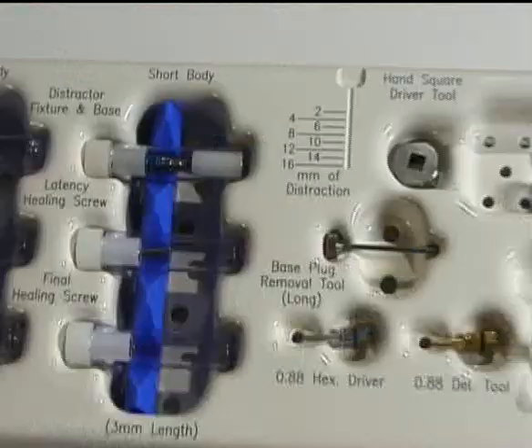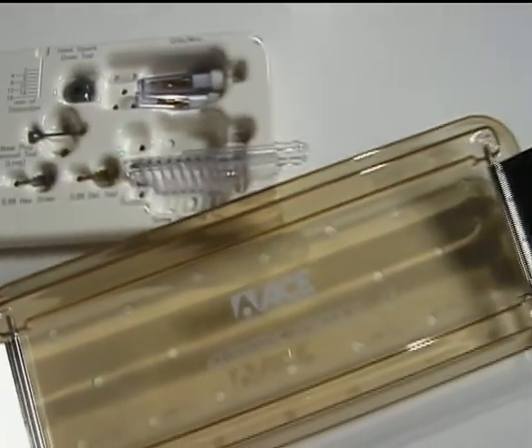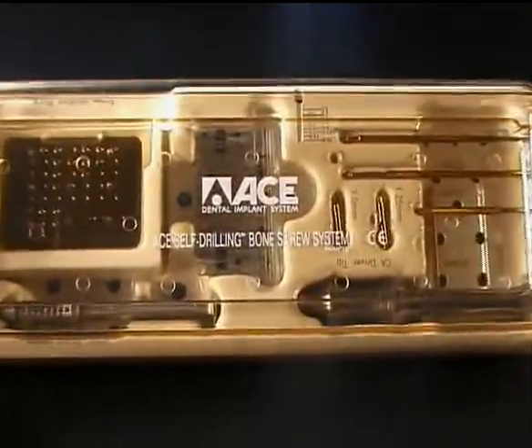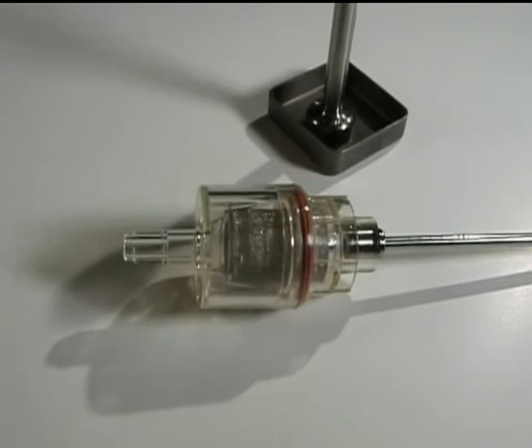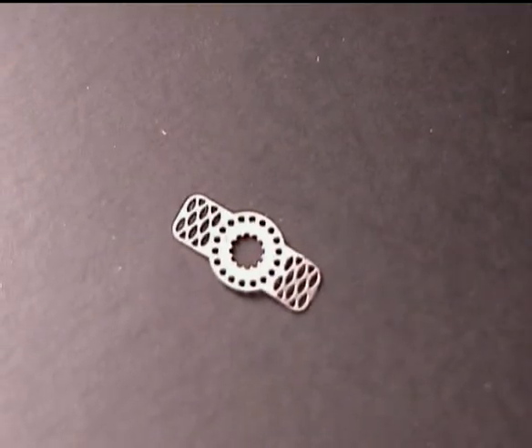ACE Surgical was the first to design the alveolar osteogenic distractor, the self-drilling bone screw system, the gradual step straight and offset osteotomes, the rigid fixation screw tack system, the surgical autografter, and the unique mesh and tenting screw system.